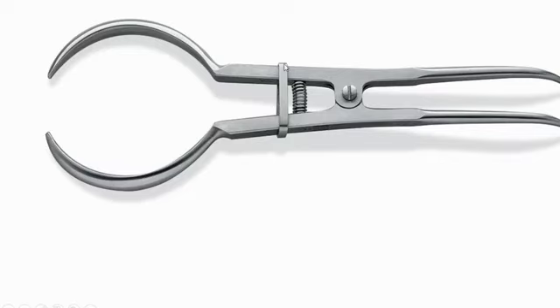और एक अच्छा एडवांटेज इस कंपोनेंट का है कि when you have attached your forceps tips to the clamp holes, you can just lock it, you can push it back and lock it. तो आपका हाथ अगर लूज भी हो जाए तो वो खुलेगा नहीं, because the lock will help it to stay open. तो आराम से you can place it on the tooth. When I'll show you the video of placing a rubber dam, you will understand in a better way. Just remember there is a handle, there is the lock which helps in locking, and there are the tips.